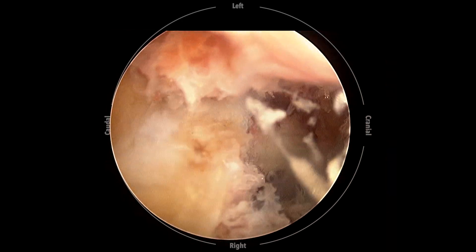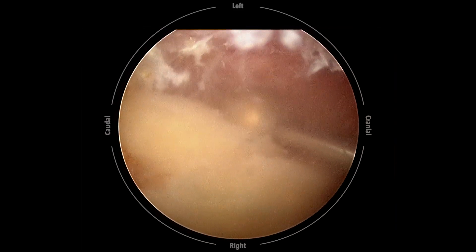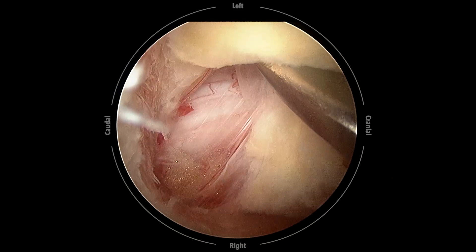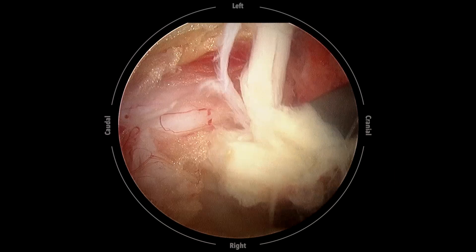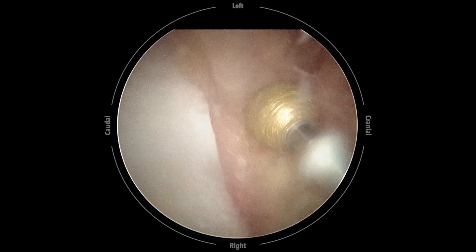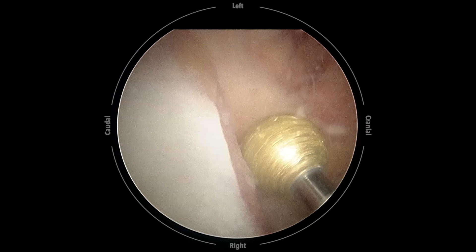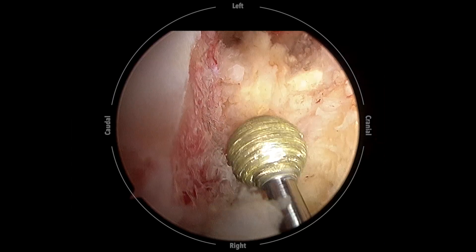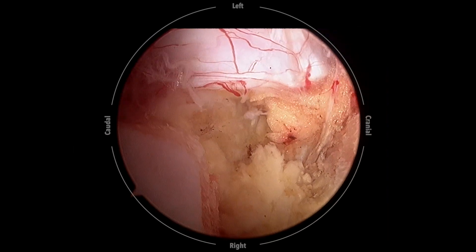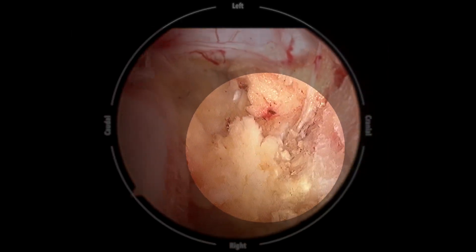These bone chips are used as autologous bone grafts. Direct neural decompression is achieved by sublaminal decompression to the contralateral lateral recess, and then the ligamentum flavum is removed as a whole piece. The ipsilateral superior articular process of the lower vertebra is resected using osteotomes or high-speed burr to complete the total facetectomy and shape the transforaminal route. The lateral portion of the ligamentum flavum should be preserved at this stage to prevent potential nerve root injury while inserting the cage trials or interbody fusion cages.